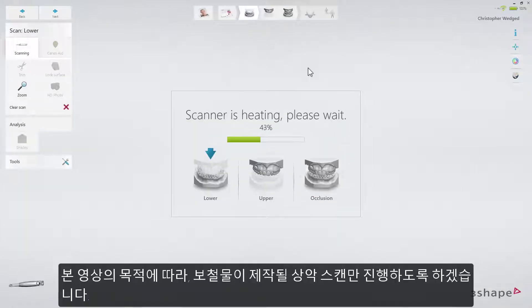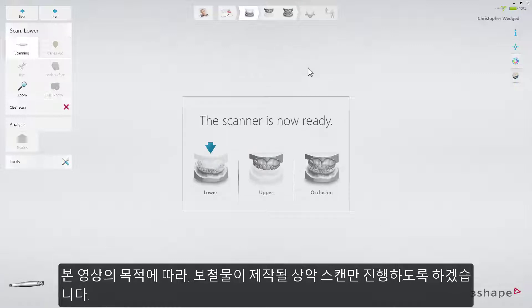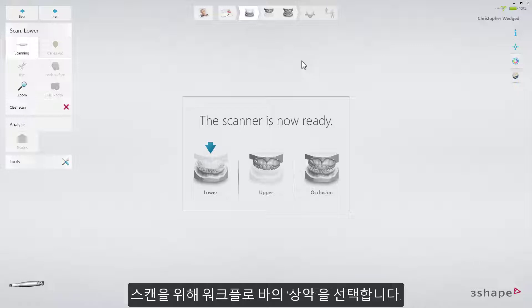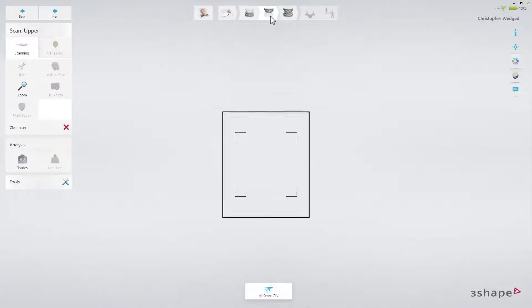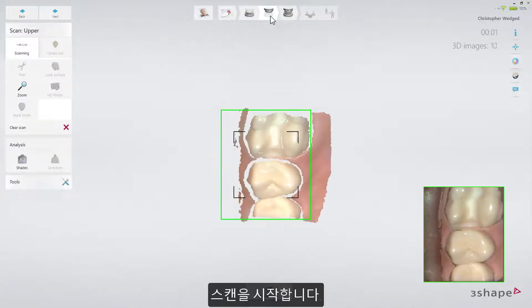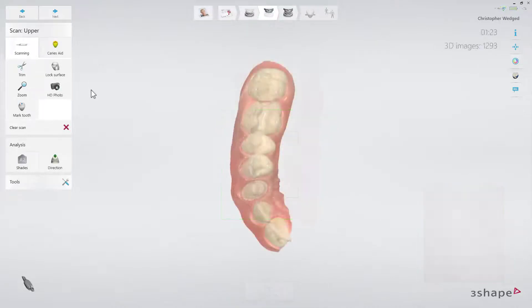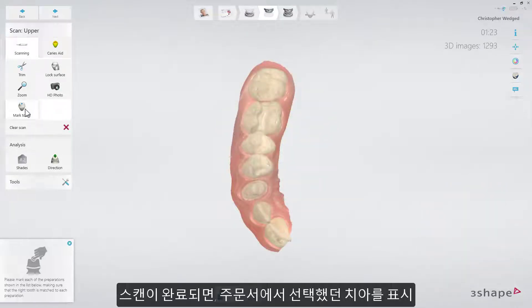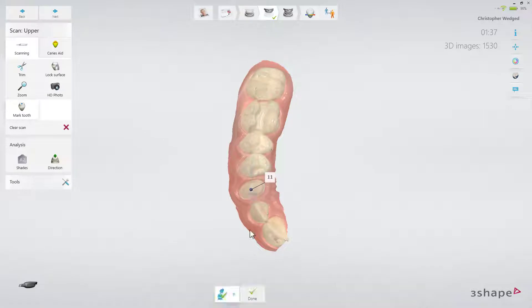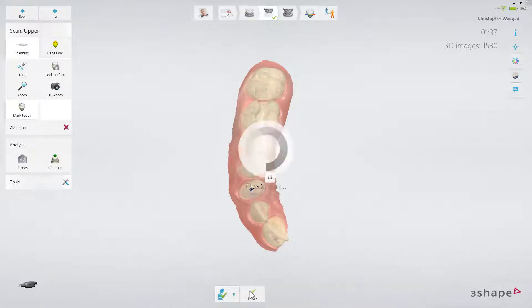For the purposes of this video, only the upper scan will be made, where the restoration is. In order to do that, select the upper arch in the workflow bar. Start scanning. When the scan is ready, mark the tooth chosen in the order form, and move to the analyze page.